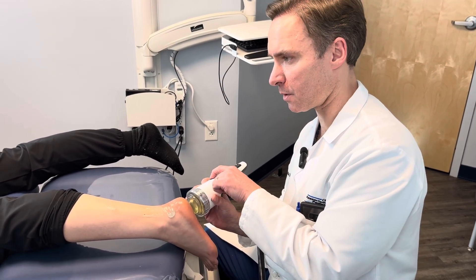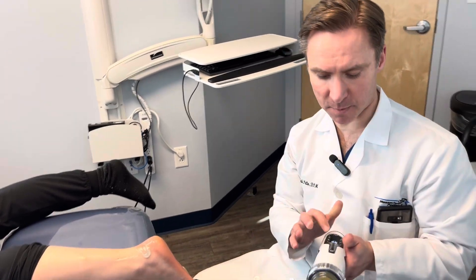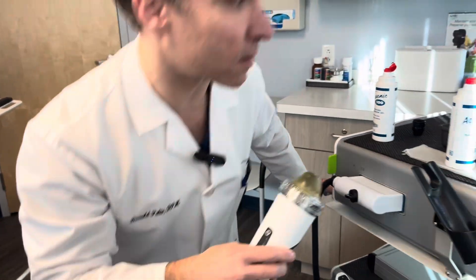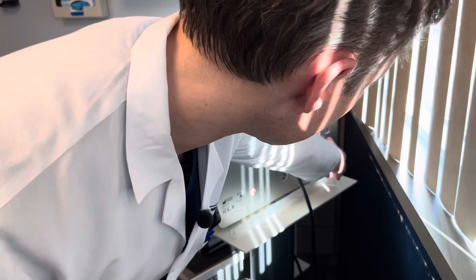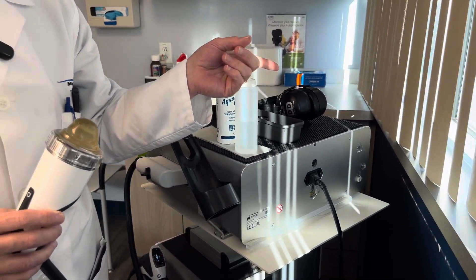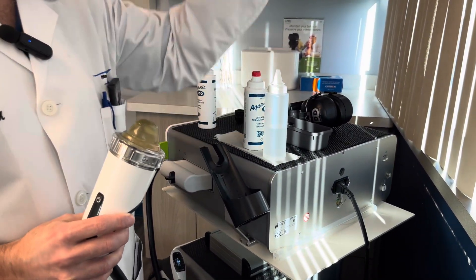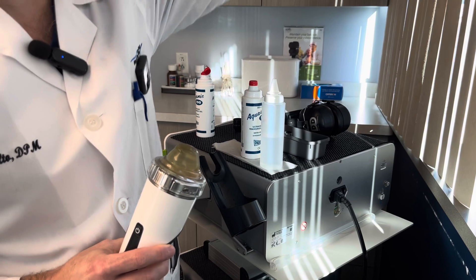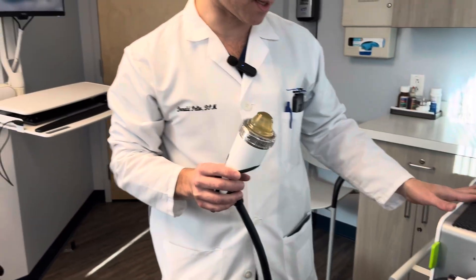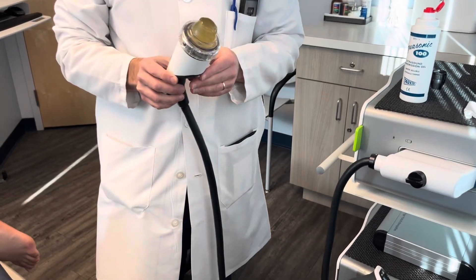The biggest problem with the focused shockwave is sometimes it shows an indicator that you need to fill it up, meaning you've run out of water in the back. There's a little connector and you have to add a tube of saline, let it drain inside, and it will fill up. That's the only maintenance issue we've had with this, aside from the bullet occasionally going through.